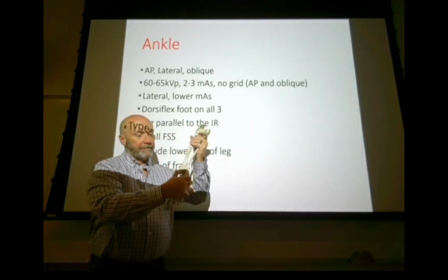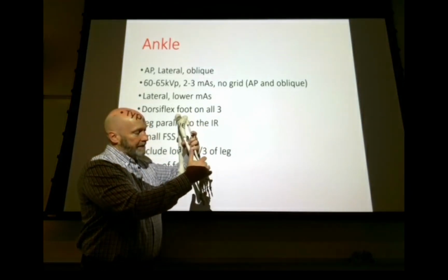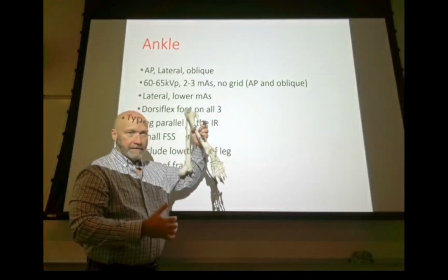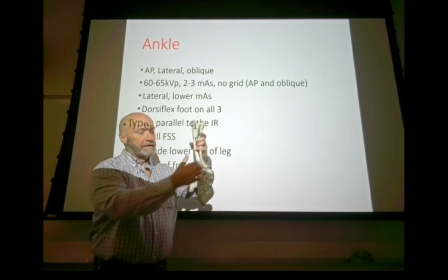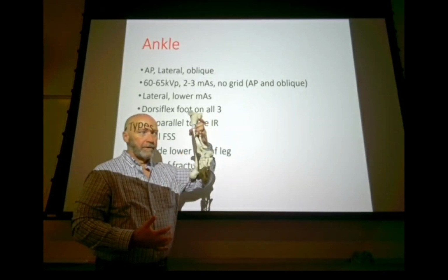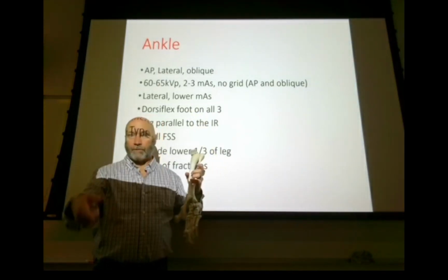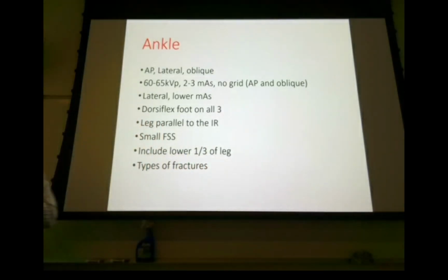The 45-degree oblique is going to be steep enough that it will project the lateral malleolus without superimposition on the tibia. Okay, so two different obliques, 45 degrees, that's specifically what we're looking for. And the 15 to 20 degree, the mortise, shows us the mortise joint all the way around the talus. Okay? It's still going to have some superimposition there though.